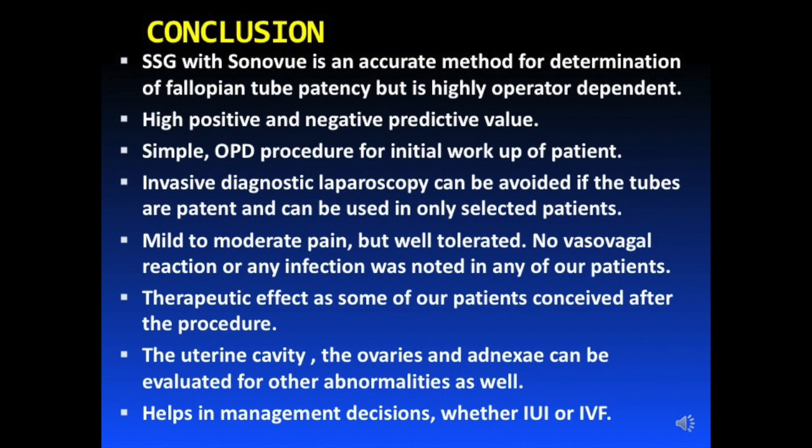Mild to moderate pain was seen in some of our patients, but well tolerated. And there was no vasovagal reaction or any infection in any of our patients. It has a therapeutic effect also, as some of our patients conceived after the procedure, especially after the flushing of the fallopian tubes. The uterine cavity, the ovaries and the adnexa can be evaluated for other abnormalities as well.